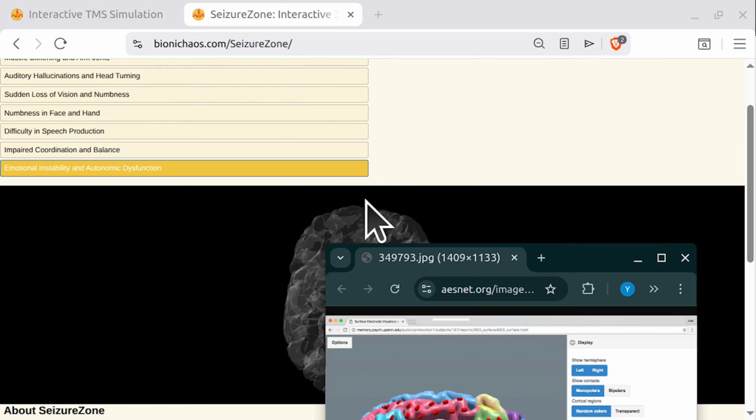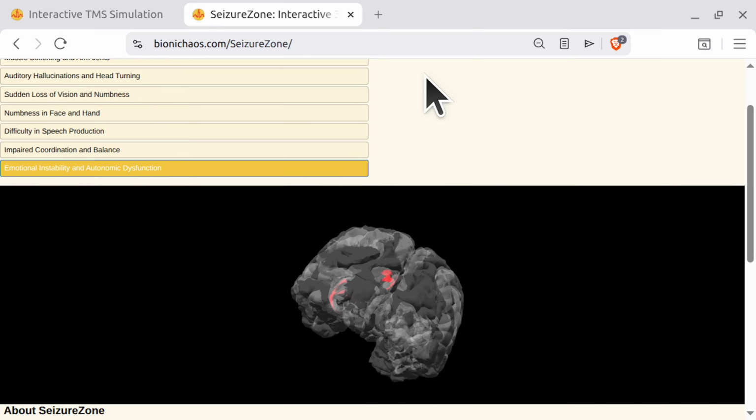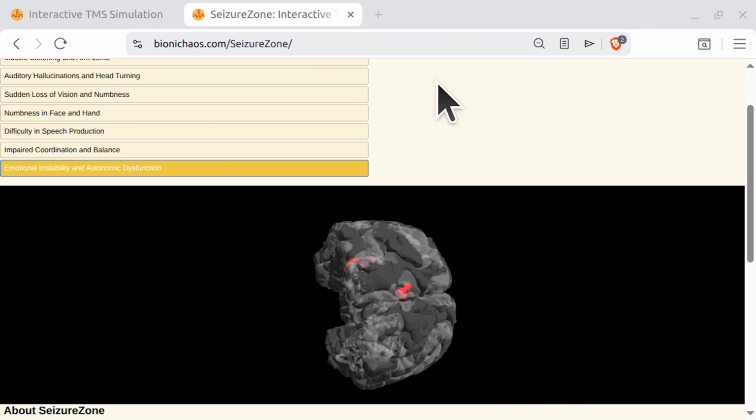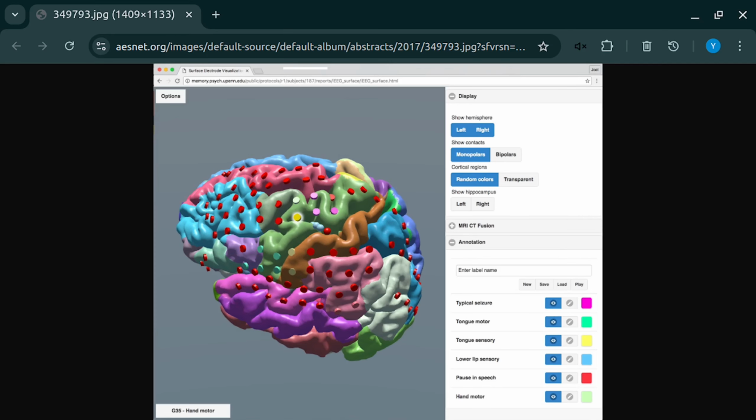So we want essentially to take one of those models that we have. I think it's a different model for the brain, also open source. And we want to be able to place EEG electrodes on top of it, and show where the locations are. Then we should also be able to simulate signal. So we can do something basic, like where we add more or less noise, because the more external you go, outer towards the surface, the more noise you'll be getting.